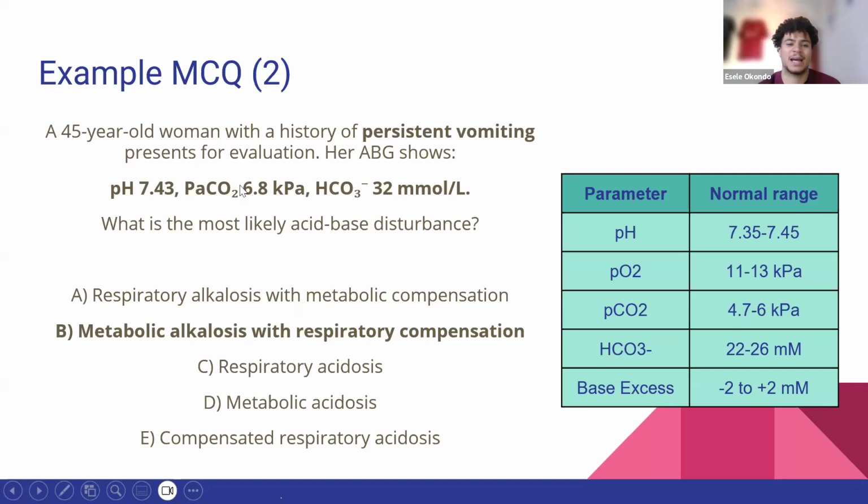And what we have here, as the pH is moving towards the alkalosis end, we have quick respiratory compensation with an increase in PaCO2 over normal. And we also have a high bicarbonate, which agrees with our higher pH, which is therefore why we have a metabolic alkalosis. And our carbon dioxide is out of range because we have respiratory compensation over the short term. So well done to everyone that answered. That was all correct.